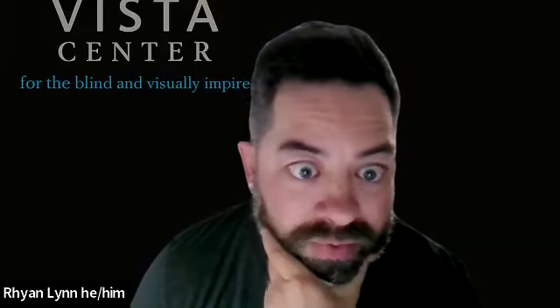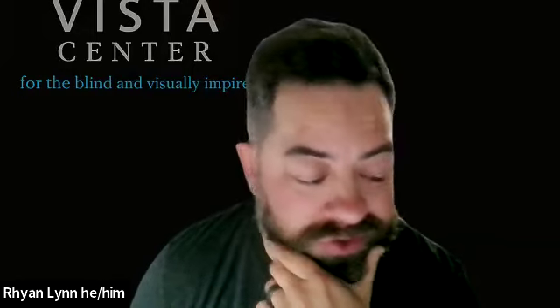Yeah, that would be wonderful if you could do a demonstration. Oh, and actually, let me do a quick walkthrough of what the glasses look and feel like. So I've got them in my hand. They look and feel like regular sunglasses. If I'm holding them facing me, the top is pretty flat, and the sides are rounded, and the bottom is more on the flat side, and then it curves towards the center. As it's facing me, on the top left corner is the camera.